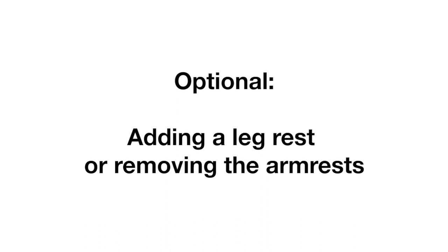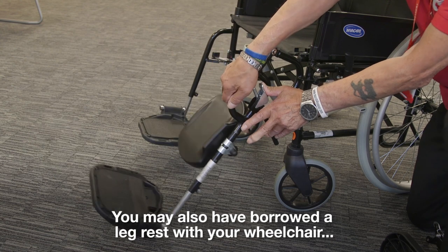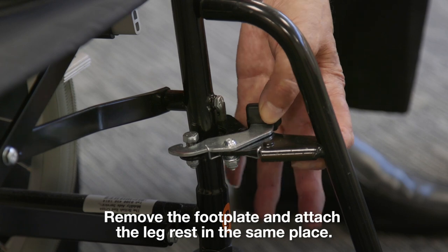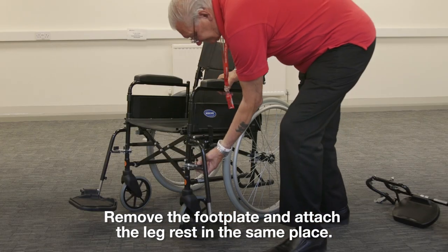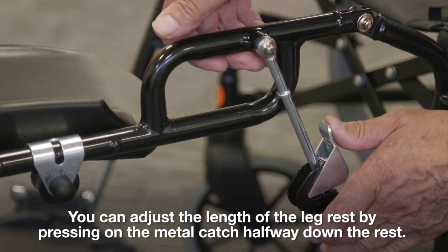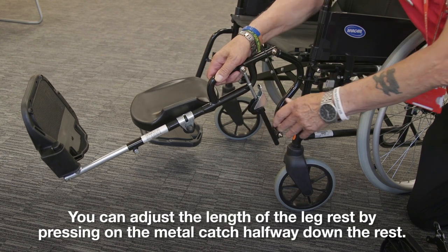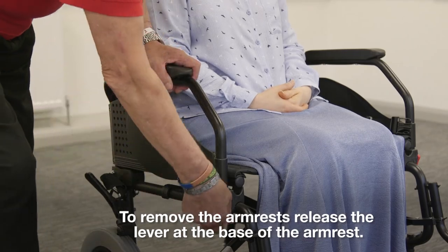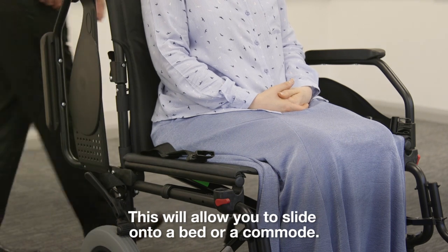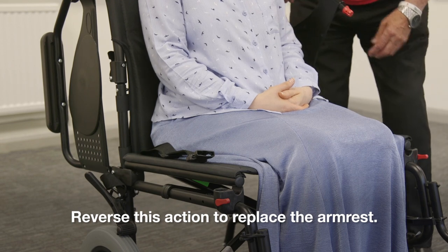Optional: adding a leg rest or removing the armrests. You may also have borrowed a leg rest with your wheelchair, which can be easily attached and removed. Remove the footplate and attach the leg rest in the same place. You can adjust the length of the leg rest by pressing on the metal catch halfway down the rest. To remove the armrests, release the lever at the base of the armrest. This will allow you to slide onto a bed or a commode. Reverse this action to replace the armrest.